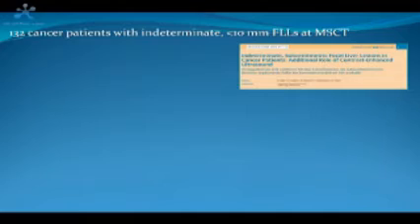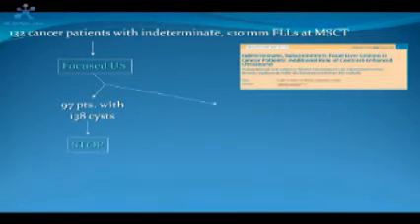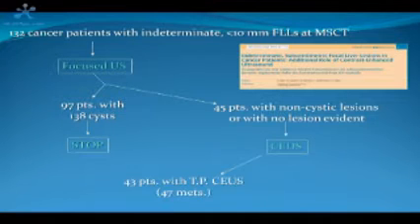So we tested CEUS in various practical scenarios. For example, the frequent case of very small focal liver lesions not determined in their final diagnosis at CT. We carried out this simple study performing a focused ultrasound. If ultrasound found a cyst, we stopped the algorithm, of course. Otherwise, we underwent CEUS, and in many cases we were able to achieve a final diagnosis.